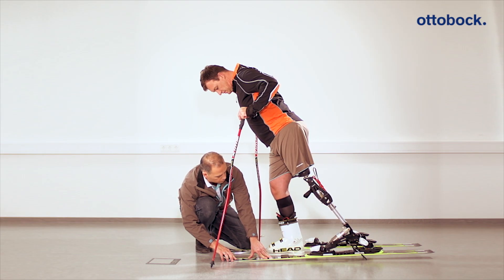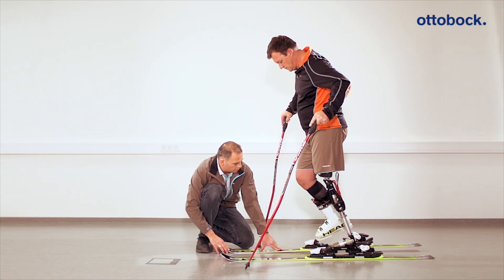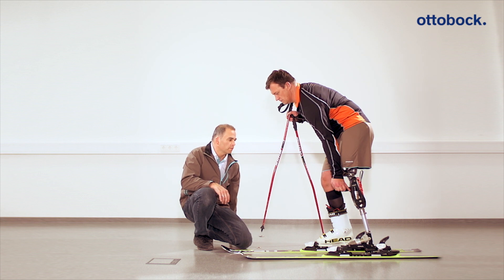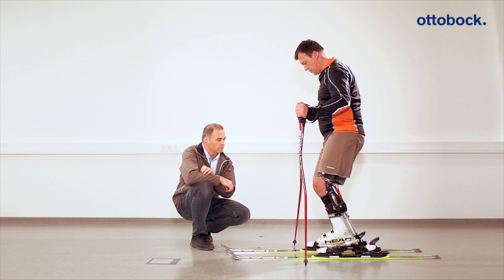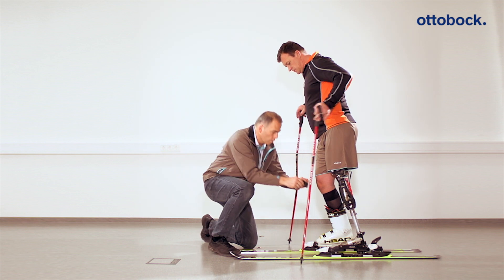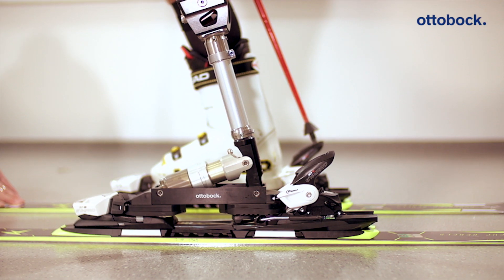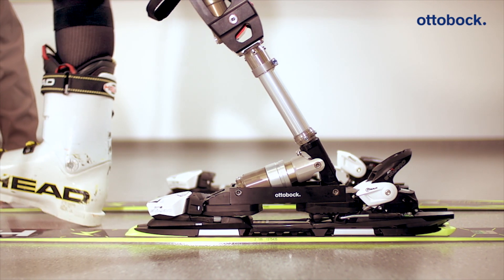So the user has steady footing, he or she should step into the ski binding with the prosthesis first and only afterwards with the intact leg. In order to get a feel for how the hydropneumatic system behaves, the blocking clip is removed for this. Once the user has steady footing, he or she should become familiar with the system and perform initial exercises while standing. Note: for the patient to be able to step back out of the ski binding, the blocking clip must be reinserted first to allow the patient to walk without spring movement of the knee joint and get a steady footing.